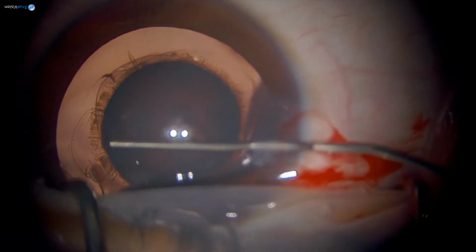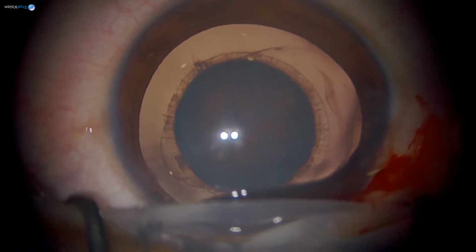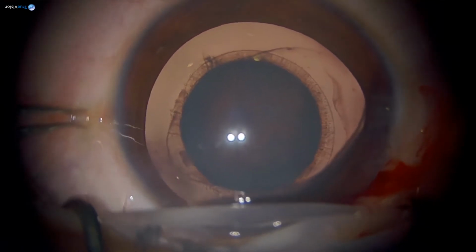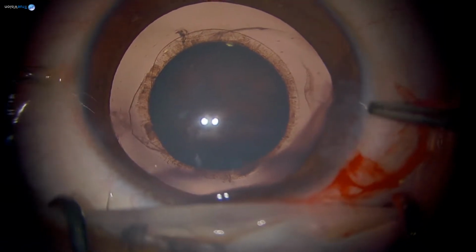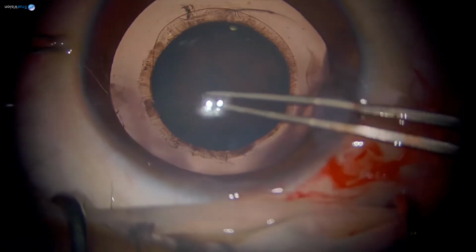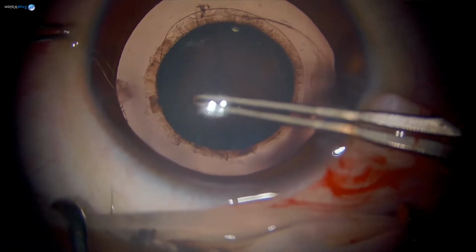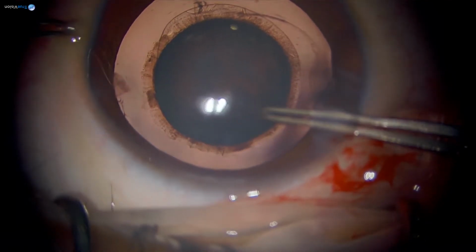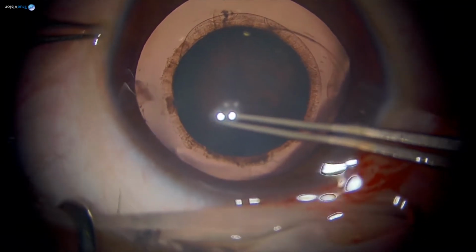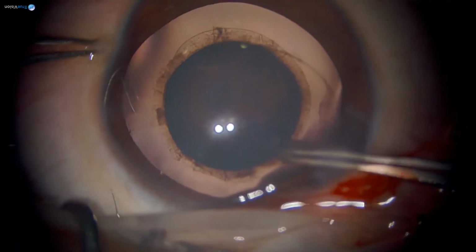So you can see the last part is still there, so I need to take it out. In the initial part of the training, it's better to go in and come out as much as you want. You want this rhexis to be clear, round and regular. Whether the hydro procedure is required. In a kid, probably it's not required because it may not make anything better for you. In an adult, probably it's required.